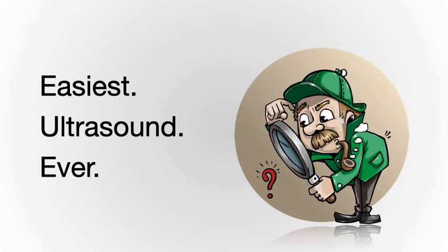I know what you're thinking. This looks pretty easy. I mean, those examples were pretty obvious. There's no way that you could not find the aorta and measure it appropriately, but it can be harder than it looks. So let's talk about some of the reasons why people may have difficulty seeing the aorta.